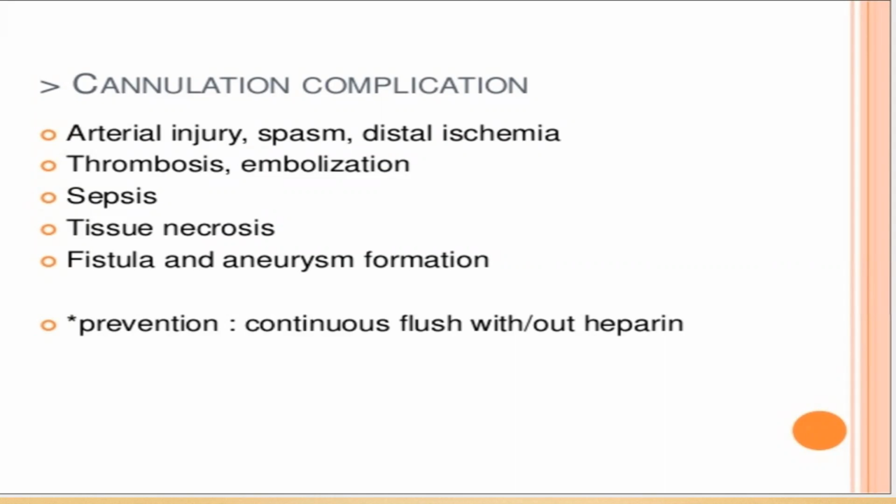Cannulation complications include arterial injury, spasm, distal ischemia, thrombosis, embolization, sepsis, tissue necrosis, fistula, and aneurysm formation. Prevention: continuous flush with or without heparin.